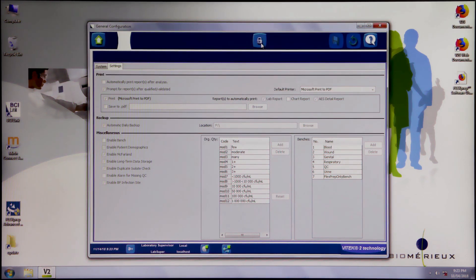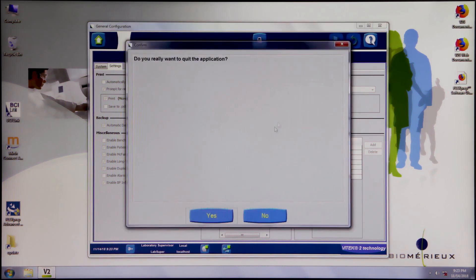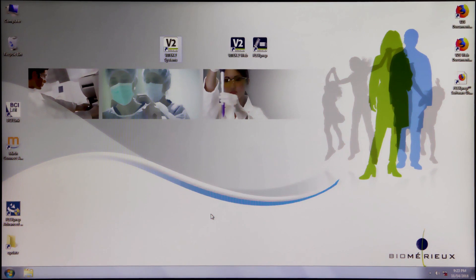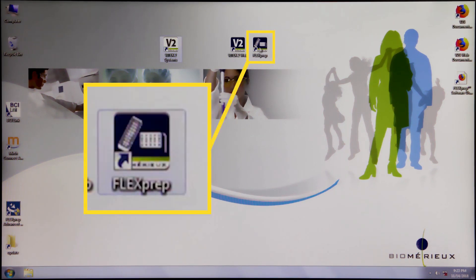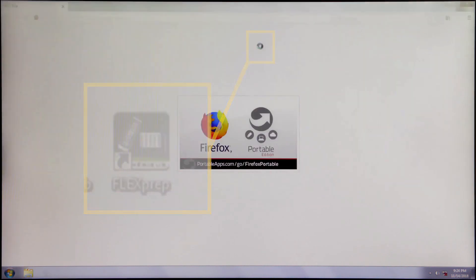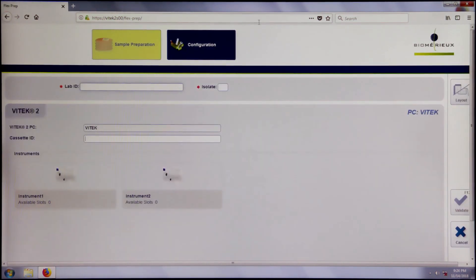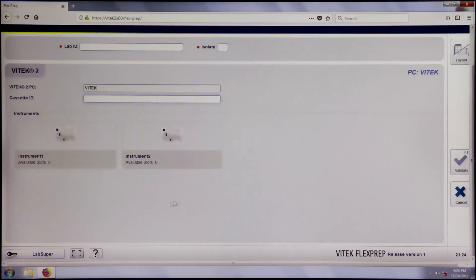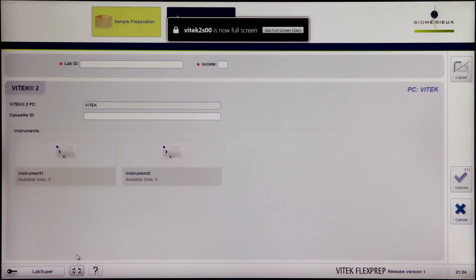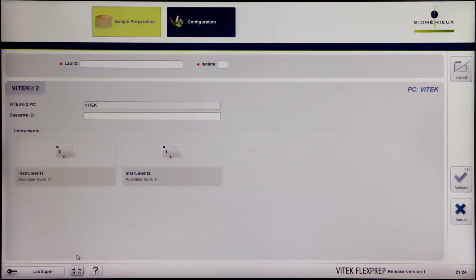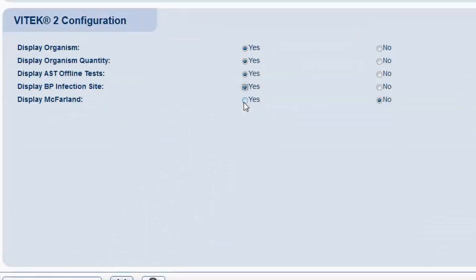Close out of the Vitek 2 Systems application. Open Vitek FlexPrep by clicking the FlexPrep icon on the computer desktop. Log in as a supervisor or administrator. By default, the sample preparation screen will display. Enter full screen mode. Click on the Configuration button at the top of the screen. In Configuration view, click Yes for Display McFarland.